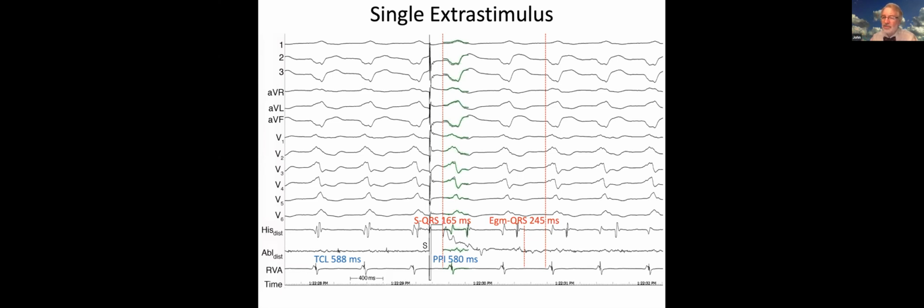This is pretty funny stuff going on in this circuit here. So it's getting out to the exit sooner than we think, but it's going through an inner loop in an okay fashion. Pretty interesting stuff. So I'm not sure how I would interpret this site. I know what happened in this guy. He did really well when we ablated at that site. But here we're talking about far field capture, and it's a non-specific result. Really can't interpret this too well.